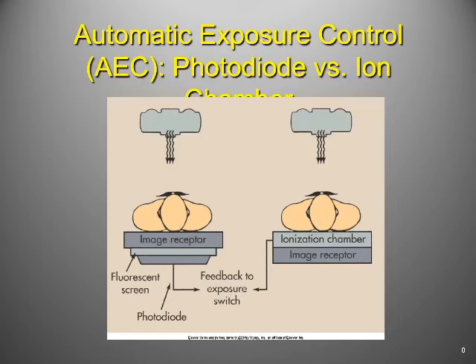Why would that be helpful to us as X-ray techs? Well, if I can measure the amount of radiation that's reaching this triad pattern, then I know I've got a chest X-ray. Or no, I need to keep on exposing this person until I've got a chest X-ray. It can tell my machine when to cut off. And that's why we call it an automatic exposure controller, an AEC.